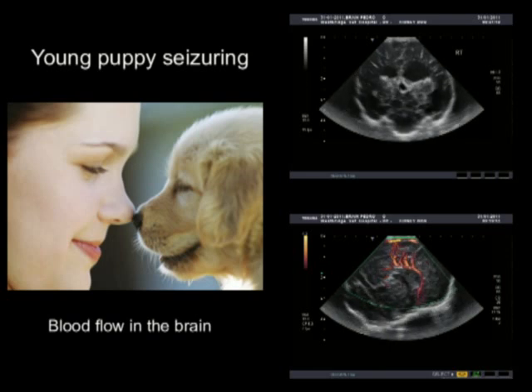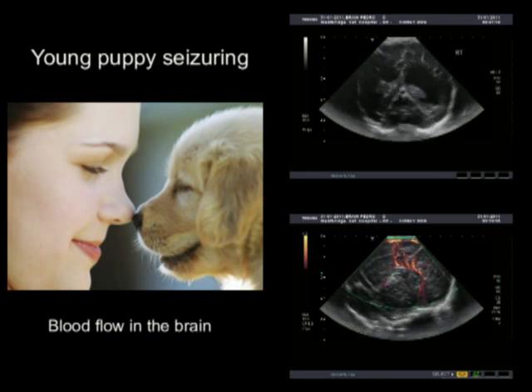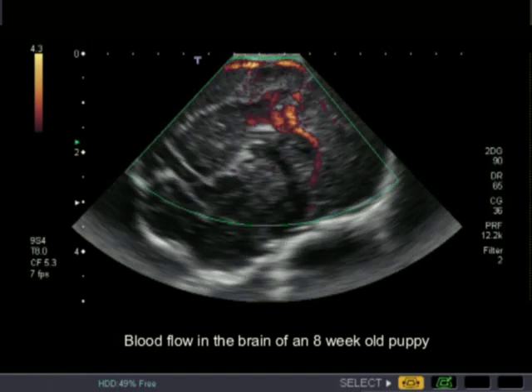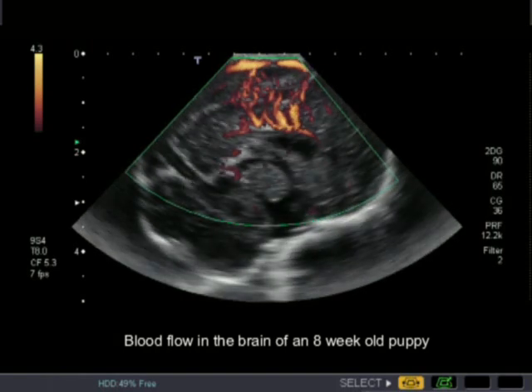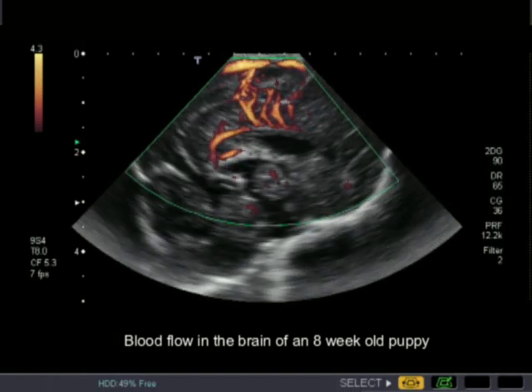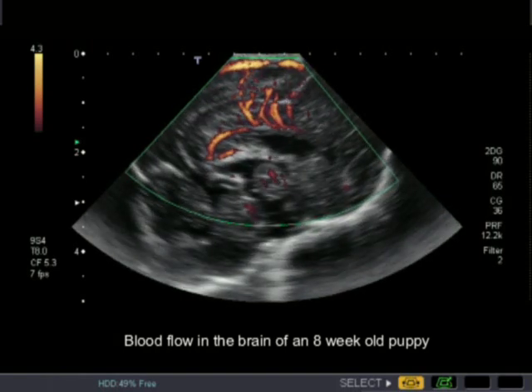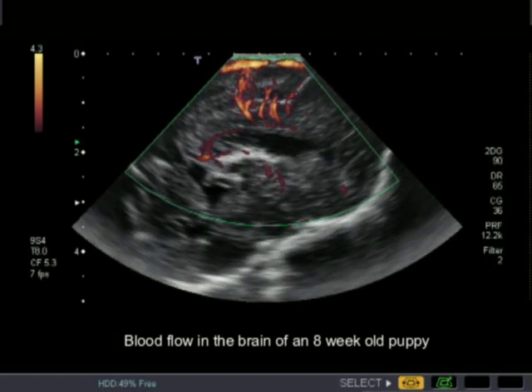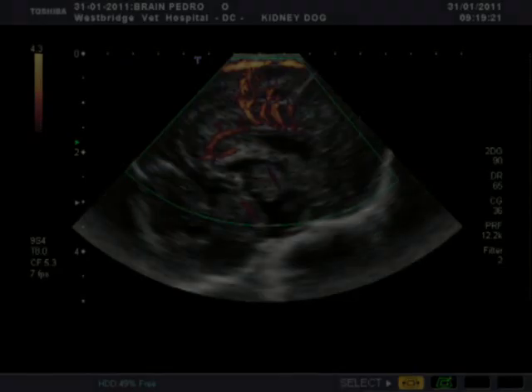A little puppy was seizing. With ultrasound, by a certain age, we can actually look at the brain — and in this particular case, we evaluated the blood flow through its ventricles.